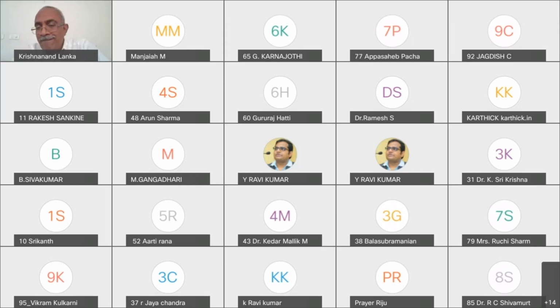Actually, the funny thing about this particular aspect is initially you start with the slicing only. Then from those slices, you try to reconstruct a 3D model which is in the form of DICOM format, and from that you reconstruct using Mimics to give it a complete 3D format.